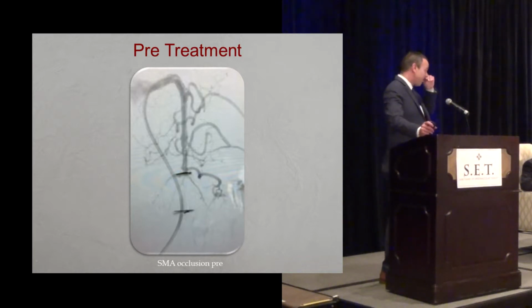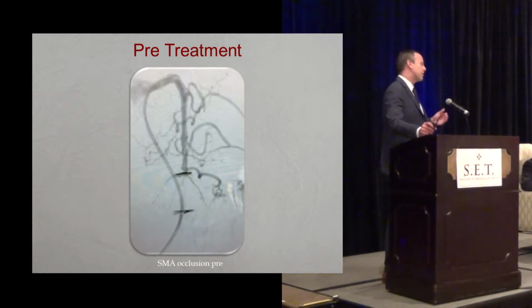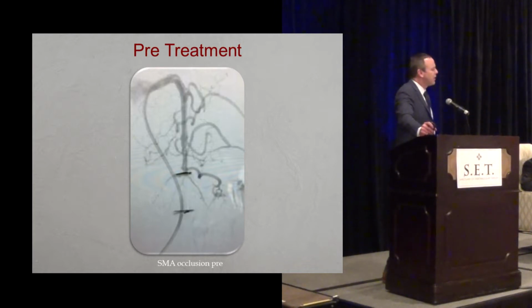So I like to be able to get this patient up to the cath lab. You can see here an abrupt cutoff, rather distal in the SMA. Then going up, as I spoke with Josh here, typically I will just use a Pinnacle sheath. This is the 8 French, I'll use the Cat 8. But sometimes if I can't get it to track or it's tough to go around that curve, sometimes I'll use one of the deflectable catheters as well.